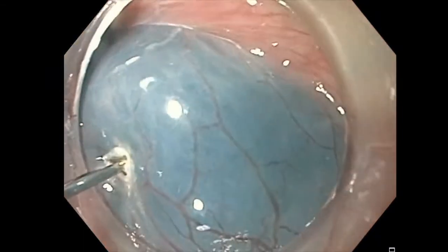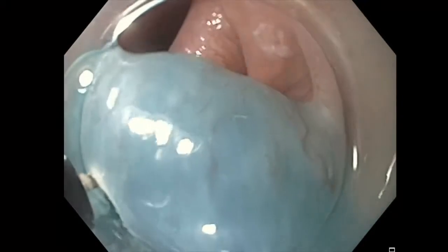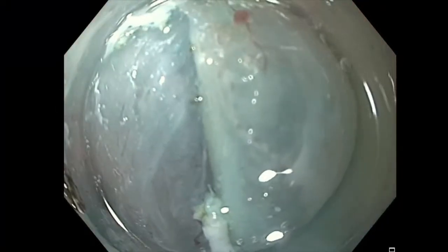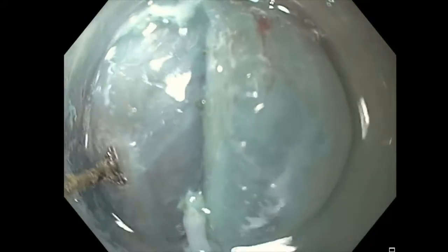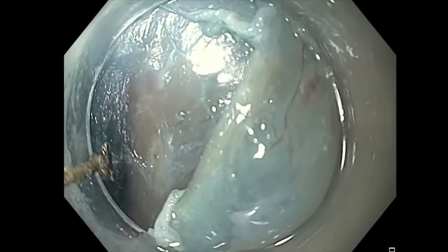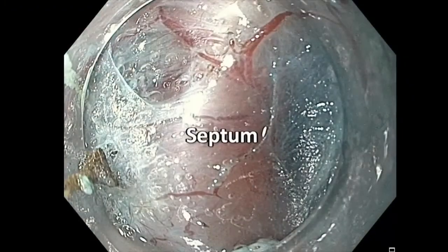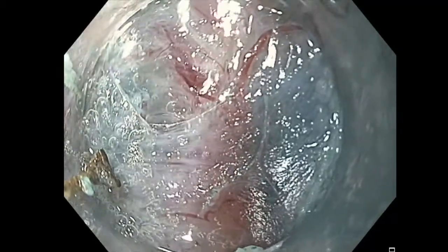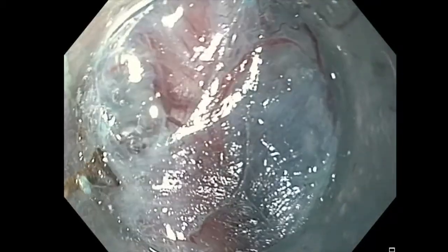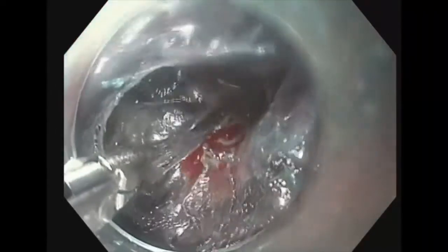A mucosal incision is then made along the axis of the septum. The use of a clear cap helps to separate tissue and improves both visualization and working space. It aids entrance to the submucosal space where tunneling is performed until the septum is reached. Injection of the premixed solution via a pump maintains visualization of the mucosal planes. Bleeding can quickly impair visualization and should be treated promptly.